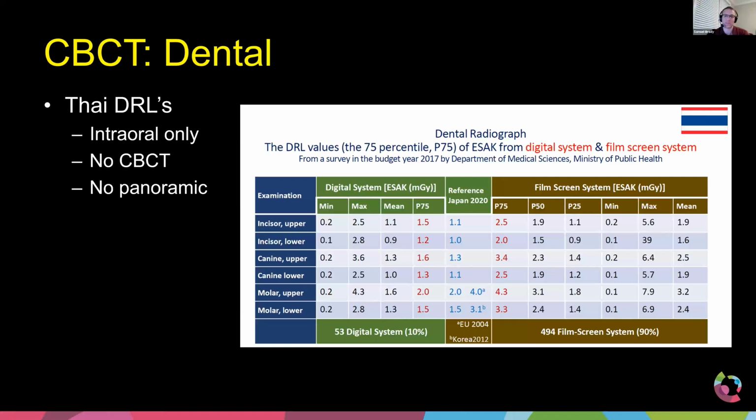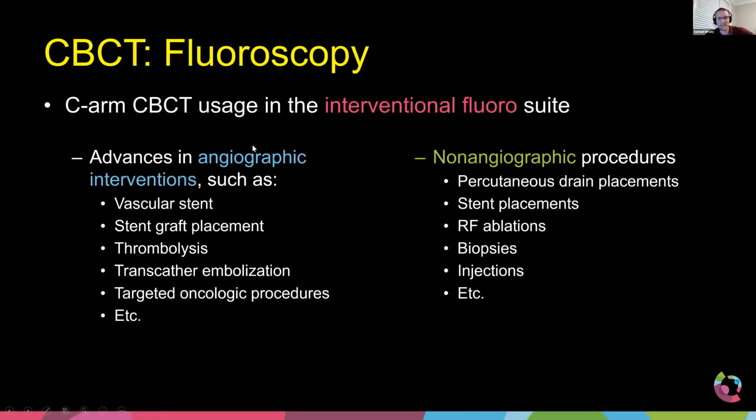for the CBCT. And I would imagine the vast majority of the dental clinics that send that data back to you guys for processing would probably mark not applicable, but you will start to see that and start collecting that, especially maybe in the larger regional areas, throughout Thailand. And you can start to collect that data towards setting up a DRL.